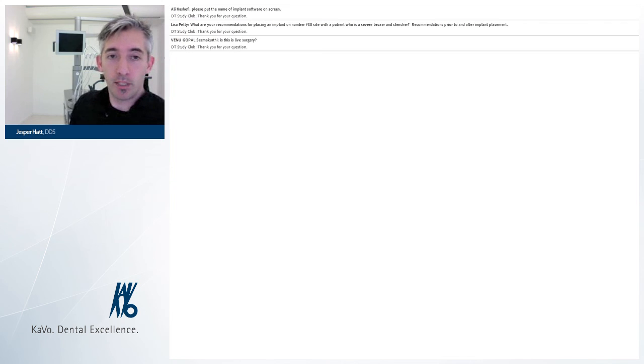So, what are your recommendations for placing an implant on number 30 site with a patient who has severe bruxism and clenching? Recommendations prior to and after implant placement. Well, that's some question. First up, I would look at the total occlusion, complete occlusion on the patient. Number 30, that's a little bit tricky. I don't know if number 31 is there as well, but if it is, that would give you some kind of protection.